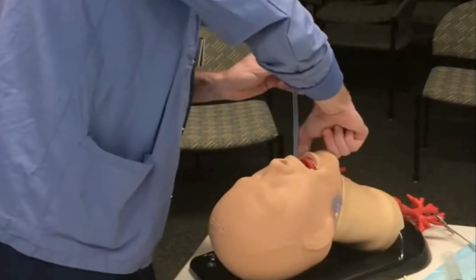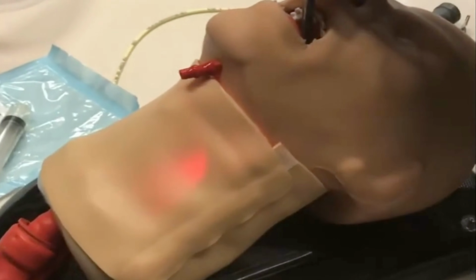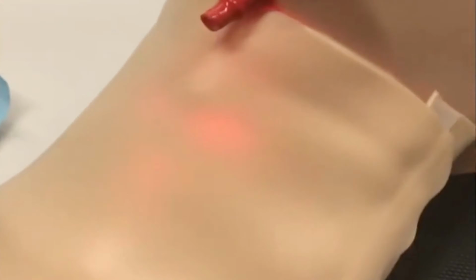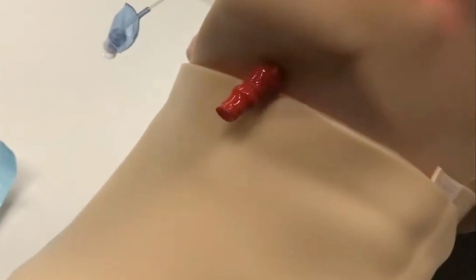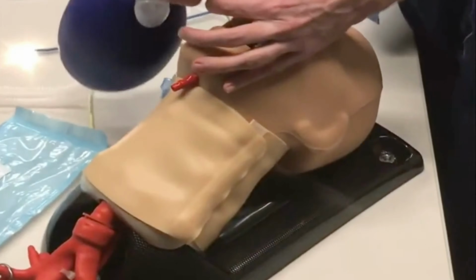As the tube advances, observe the anterior neck. A bright, well-defined glow appearing just below the thyroid cartilage indicates tracheal placement. If the glow is faint, diffuse, or spread across the neck, the tube is likely in the esophagus. Withdraw slightly and redirect. When a sharp, focused glow is seen in the midline of the neck, advance the tube smoothly into the trachea. Once the tube is in position, remove the light wand.